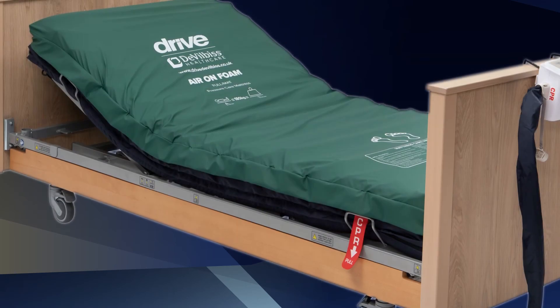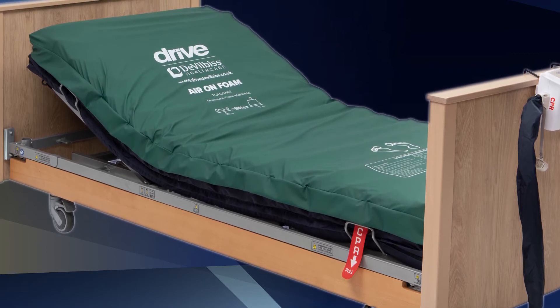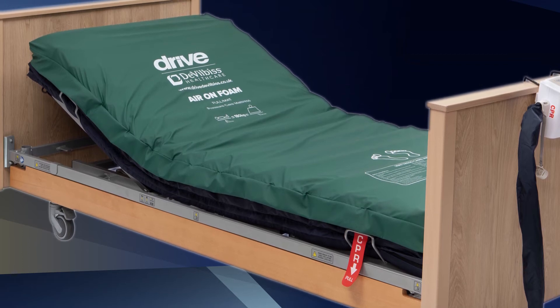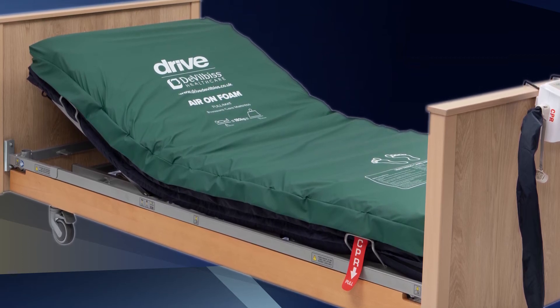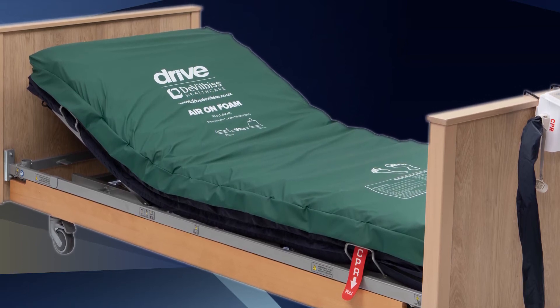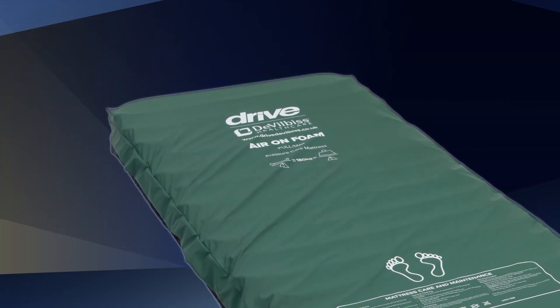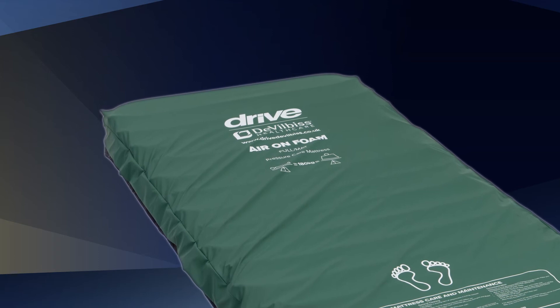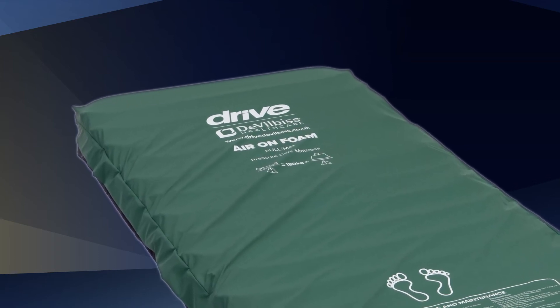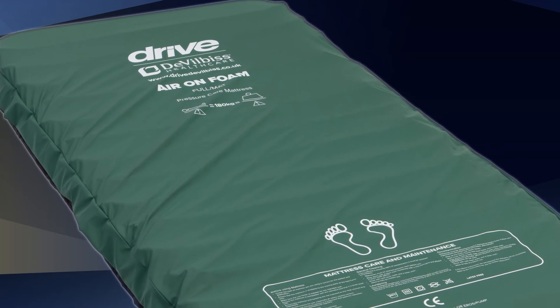The green top cover is multi-way stretch, waterproof, and vapor permeable, with a navy nylon base. Ultra Fresh, an anti-microbial agent, is fully encapsulated in the cover to help control microbial deterioration and to help extend the life of the cover. The cover clearly identifies the mattress type — in this case AirOnFoam — the maximum patient weight of 180 kilograms, and at the foot end of the mattress, the care and cleaning instructions are clearly identified.